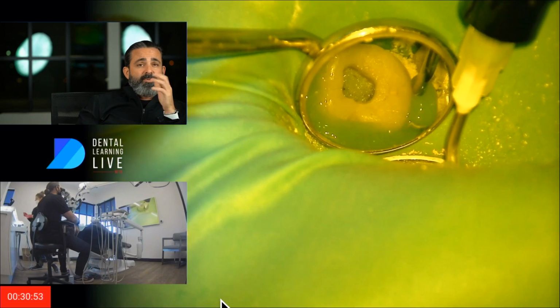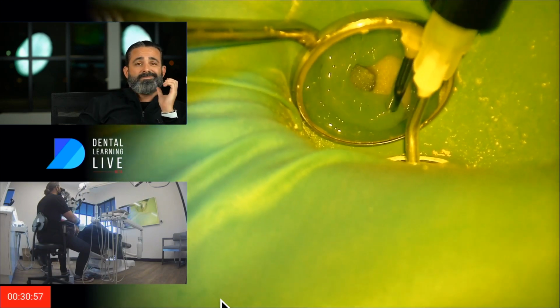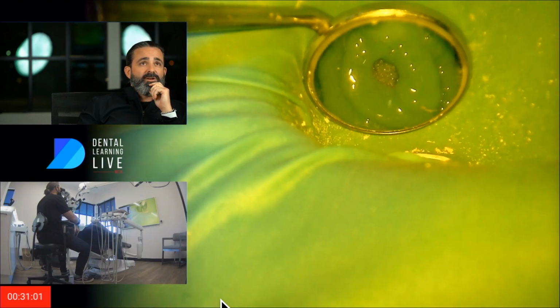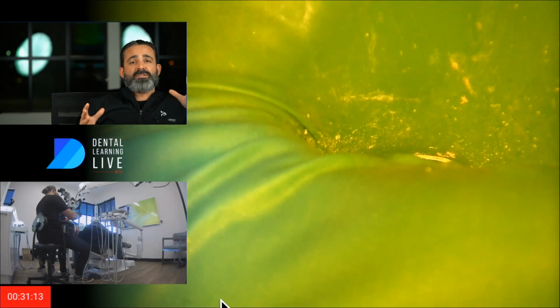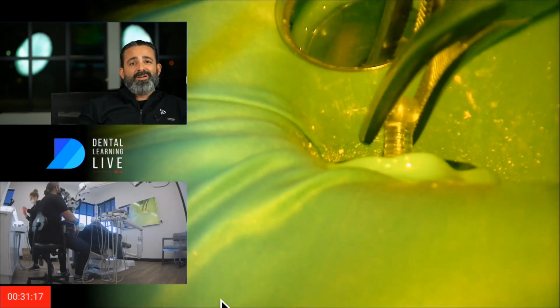So you saw me put my breadcrumb in, I put my sponge in, and at this point, I'm just glopping on the sound seal. I'm making kind of a donut around it. I like to peripherize the tooth with the sound seal. I'm not worried about leaks. I'm more worried about stability.